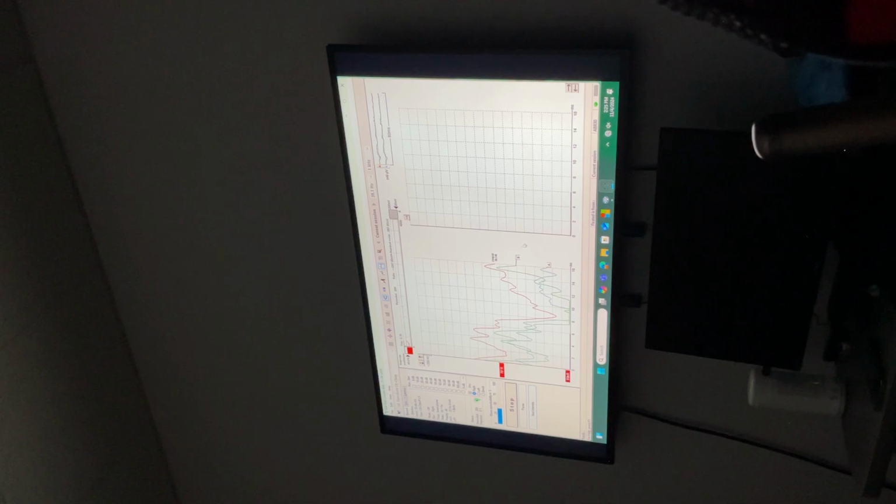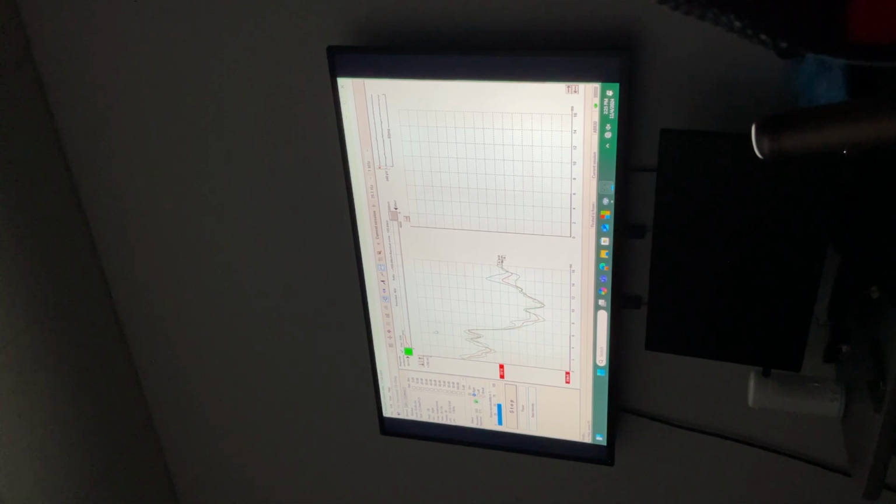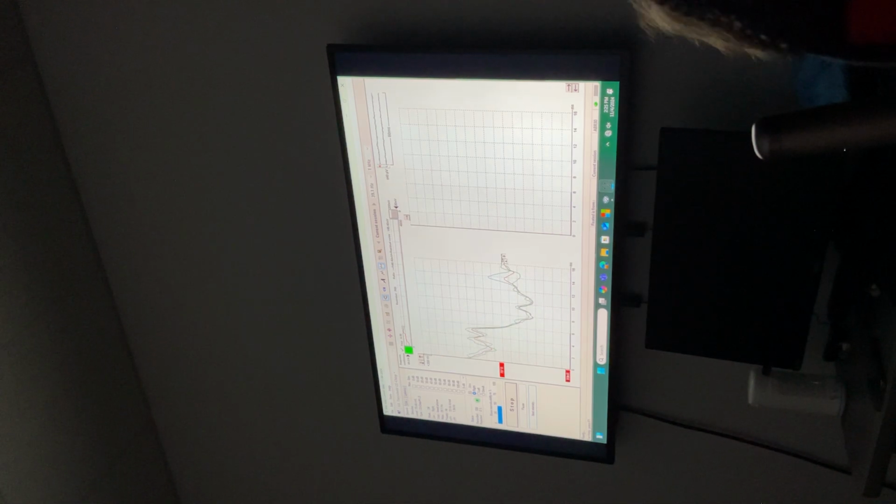The latency should be similar to click. I think there was a problem, probably because of the loopback settings. Some of the latencies were off. What do you think, Christine?